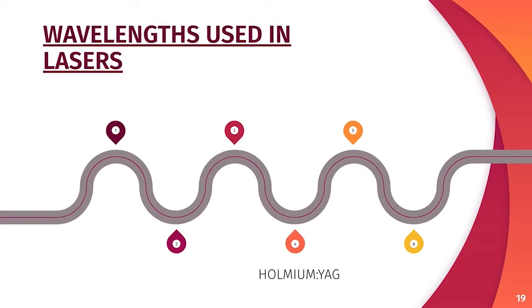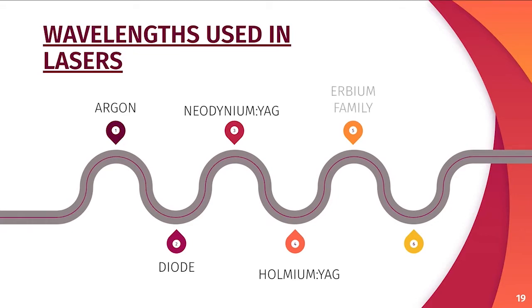In this slide we will see the wavelength used in lasers. It ranges from the smallest, argon laser, to the carbon dioxide laser.